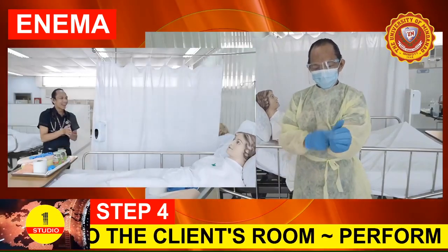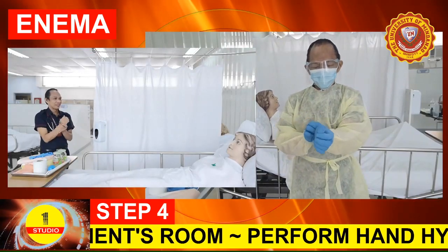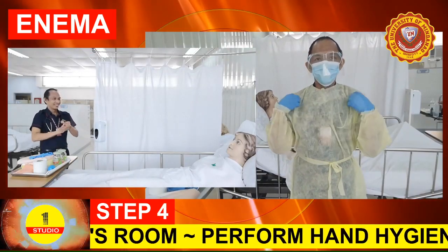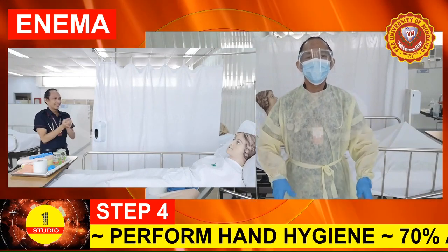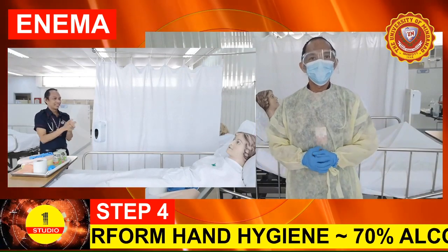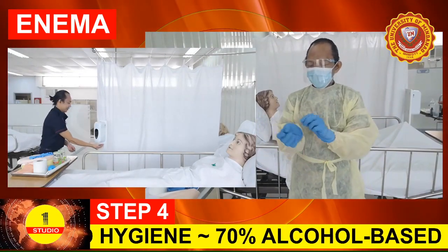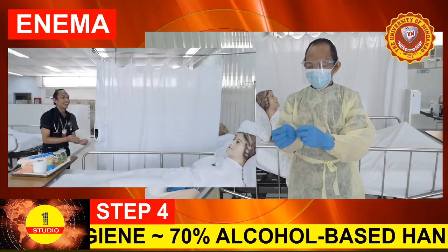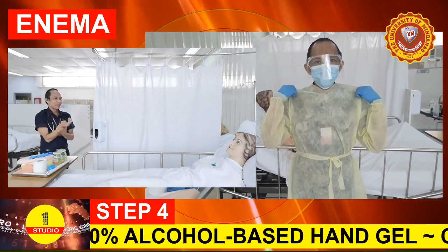Step 4. Go to the client's room. Perform hand hygiene with 70% alcohol-based hand gel. Put on a pair of clean procedure gloves, wear a gown or a plastic apron, a surgical mask, and a face shield.